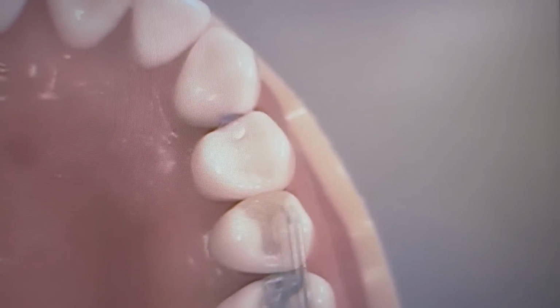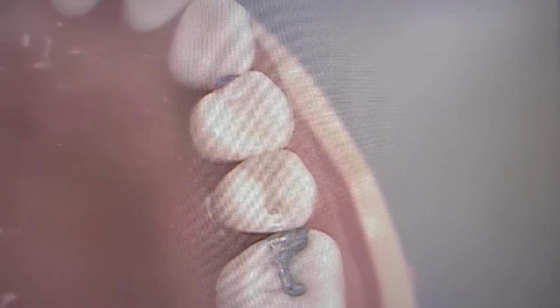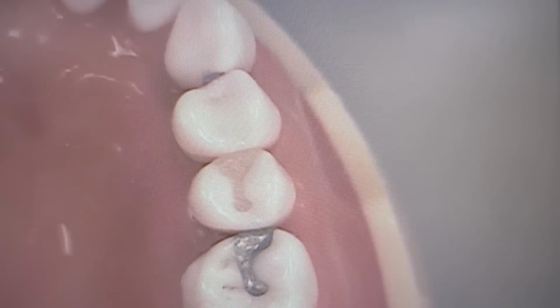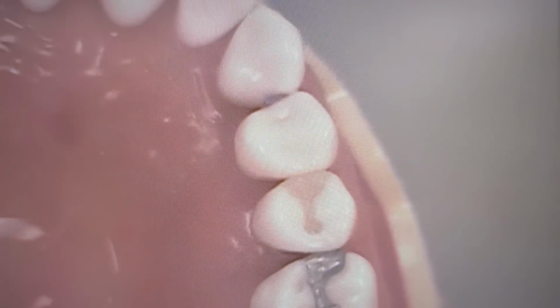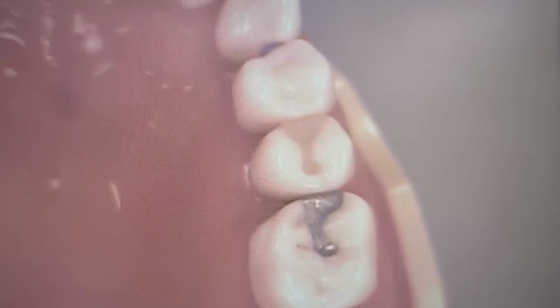The marginal ridge is a little thick. That's because these marginal ridges are quite thin. If you notice, the marginal ridge is really thin on this premolar compared to that. So probably make the hot dog smaller.